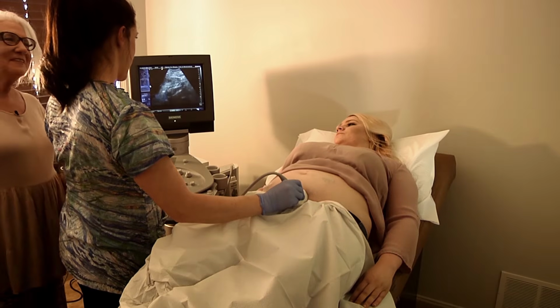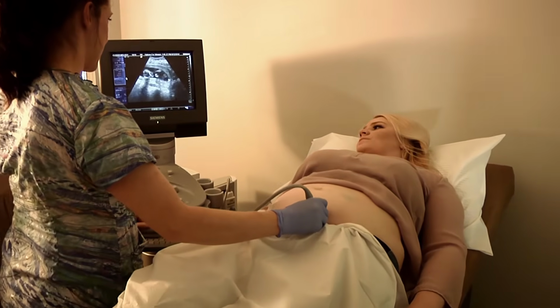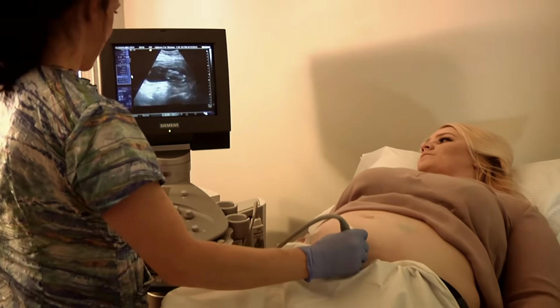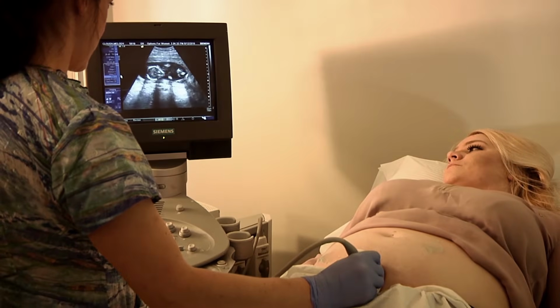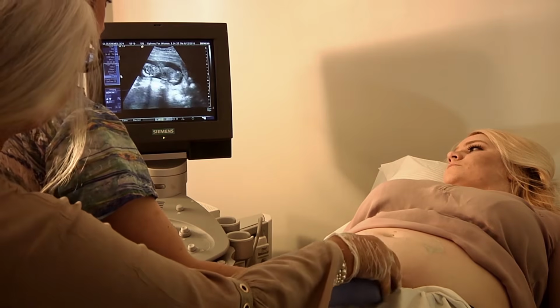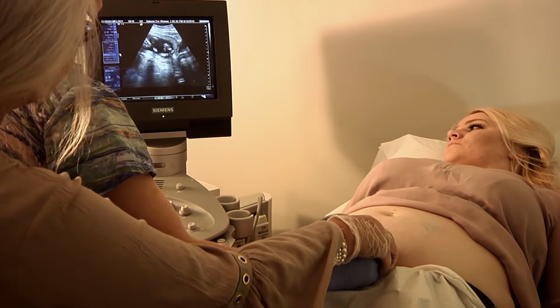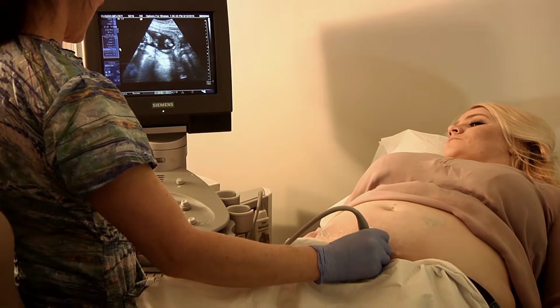Well, first I want you to take your sagittal midline. Okay. What's this looking at? Oh, at the screen right there. It is? So at this stage, I need to take an upper and a lower, right? Yep. So there's the bladder.